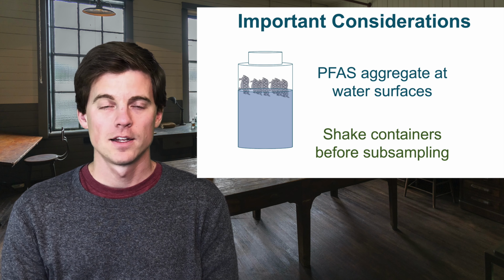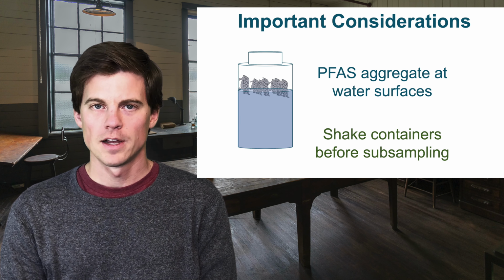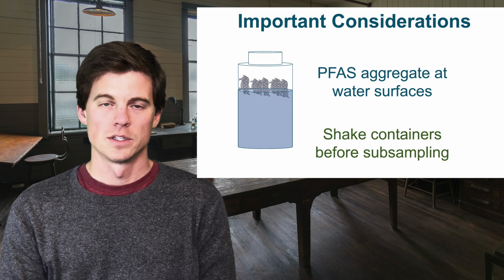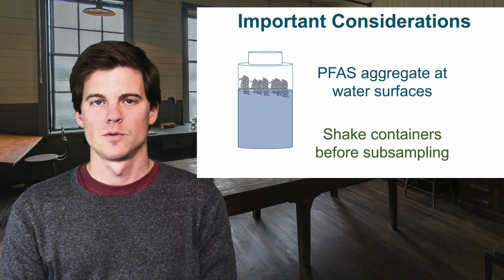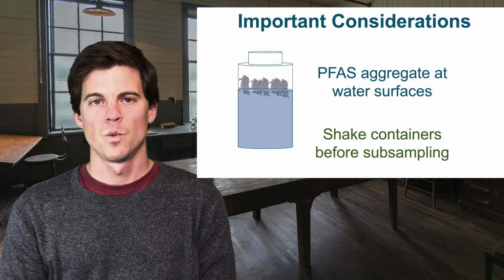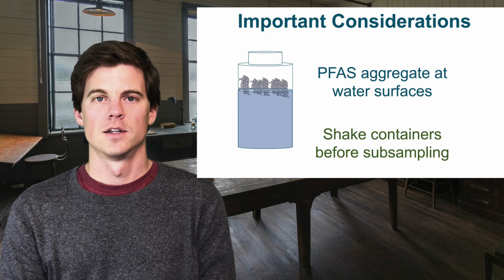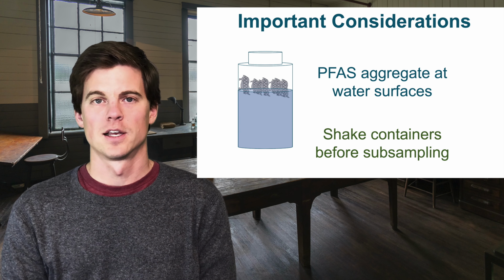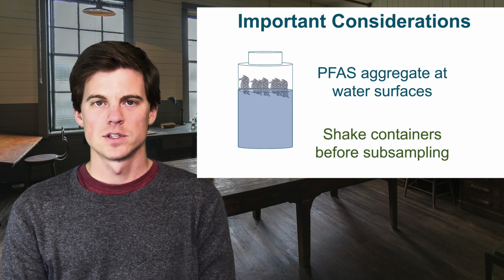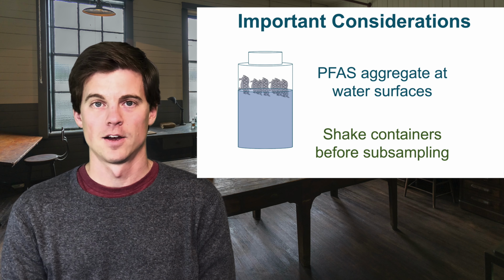So that's all for today for sample preparation. That was a very simplified version, but I just wanted to give you the basic description. Solid samples, it's kind of a shake with solvent, pull off the solvent. You can clean it up or you can analyze it straight. But with water, we can also just do dilute and shoot, or we can do sample preparation like I just showed, where you do that solid phase extraction. There's methods online. There's products sold specifically for this. You can check that out.